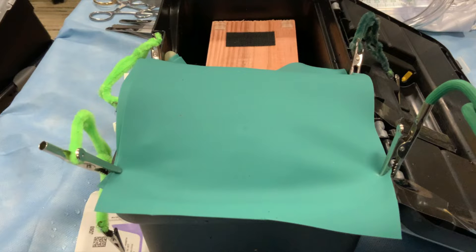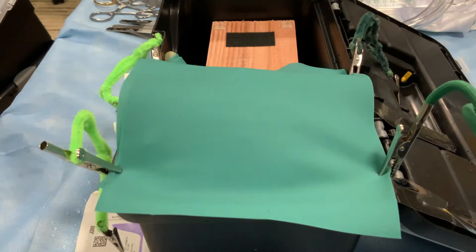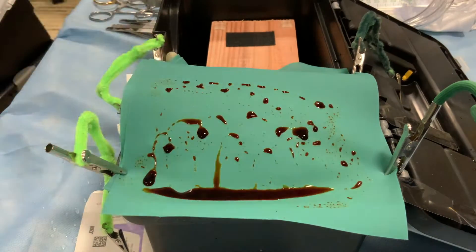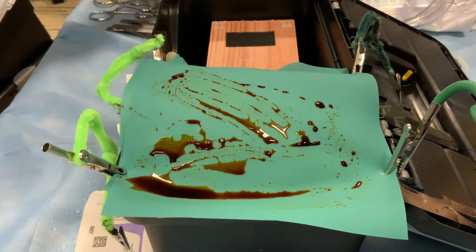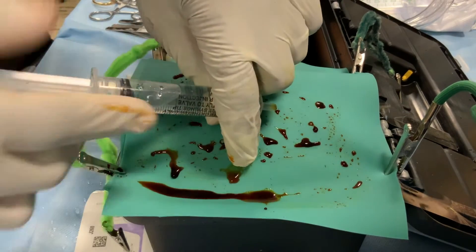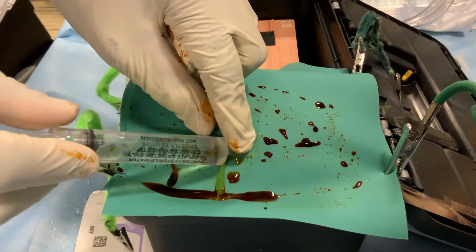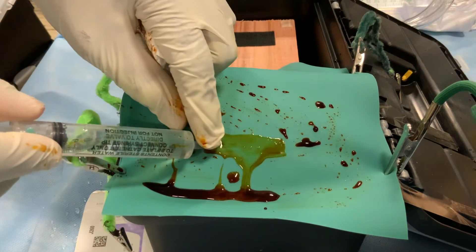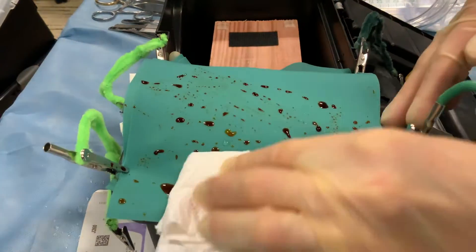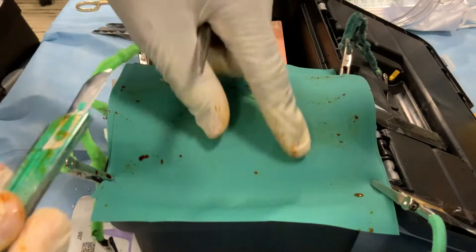Ultrasound can be used prior to incision to locate the bladder and ensure no bowel loops are between the bladder and skin, but may not always be feasible in low-resource settings. The lower abdominal area is cleaned thoroughly with iodine or another sterile surgical prep. Five milliliters of xylocaine or another local anesthetic is then injected approximately two finger breadths above the pubic symphysis, covering an approximately six centimeter wide transverse line.